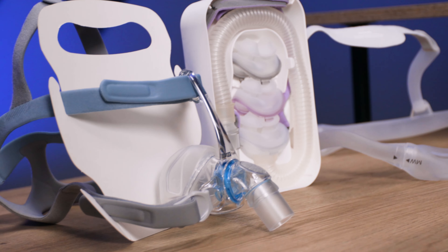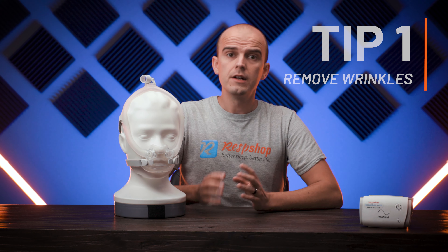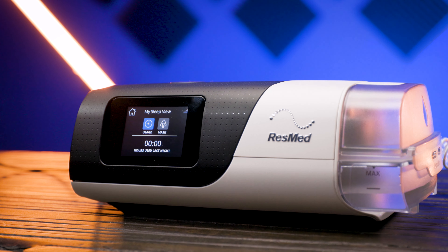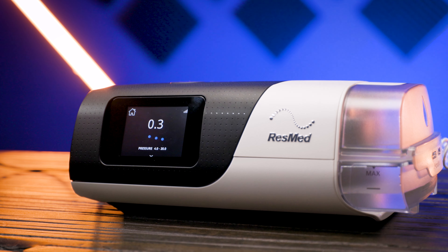Now, on to the tips. Tip number one is for those that only occasionally experience mask leaks. Sometimes leaks can be caused by wrinkles in the mask cushion, and these can form when you move around at night. Air then escapes from the cushion through those wrinkles. The fix is simple: turn off the air pressure, pull the mask away from your face, raise it, and then re-secure it. If necessary, repeat the process and move the mask around a little until the wrinkles flatten out. This should allow the cushion to reform and get a better seal. Once done, you can turn the pressure back on.